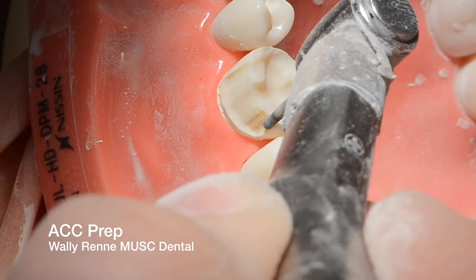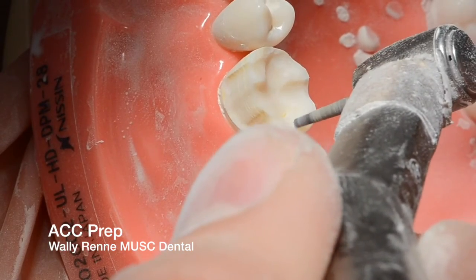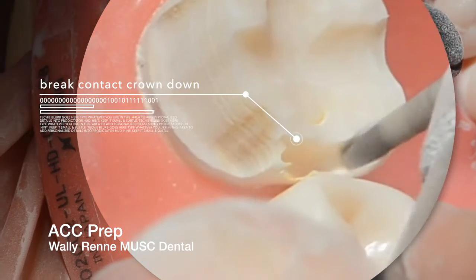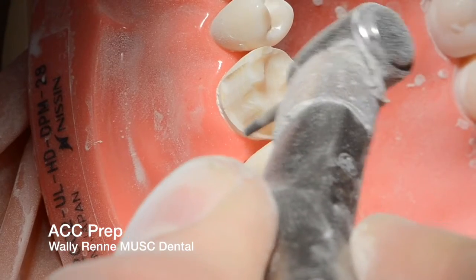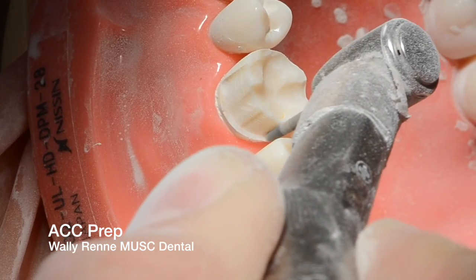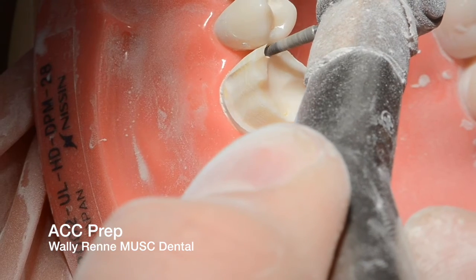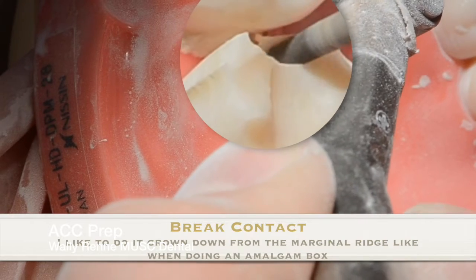Just put a little rough cut there. To go in interproximally, I like to do almost a box form like in operative — going crown down, marginal ridge down rather than coming from the side. You'll have to fit that bur in there anyway, so just go for it rather than using a miniature bur and spending three hours on it. It takes practice. You want to be visualizing the adjacent tooth the whole time, making sure you're not hitting it. Any destruction of the adjacent tooth will be considered a failure.